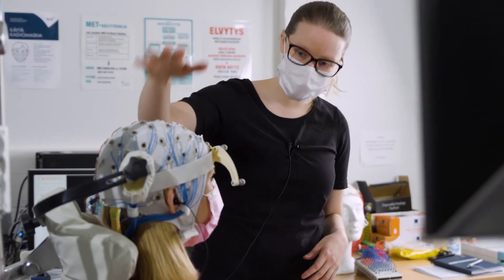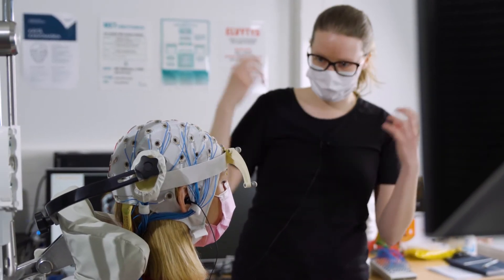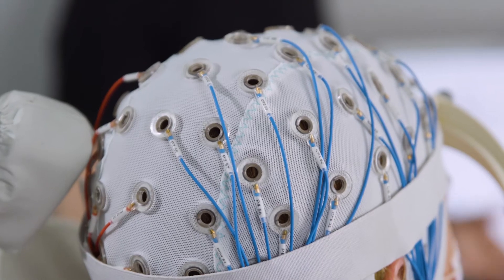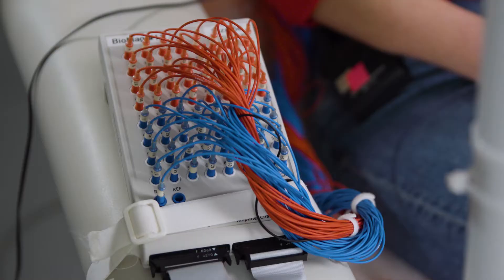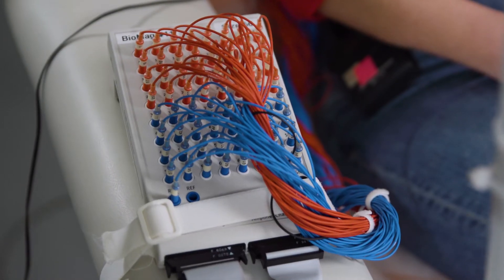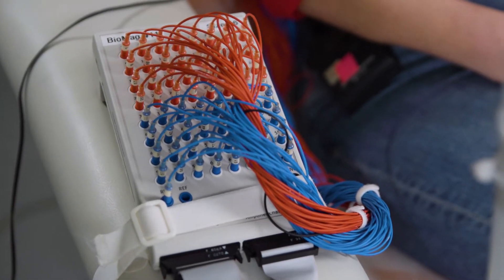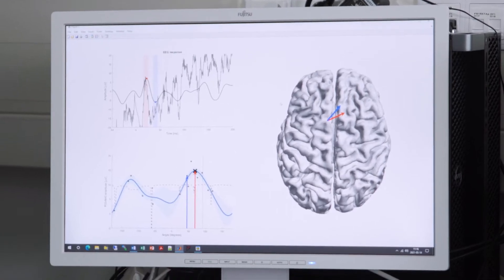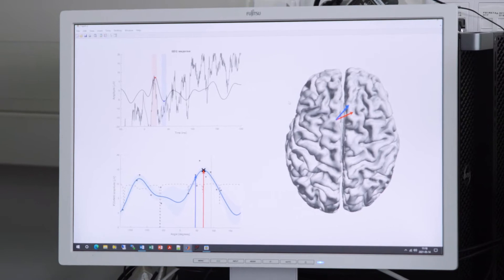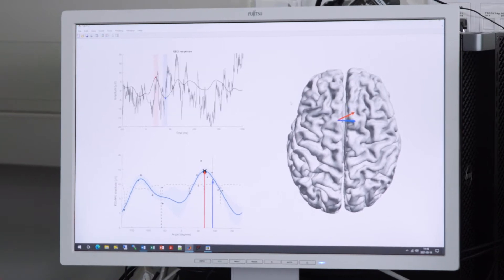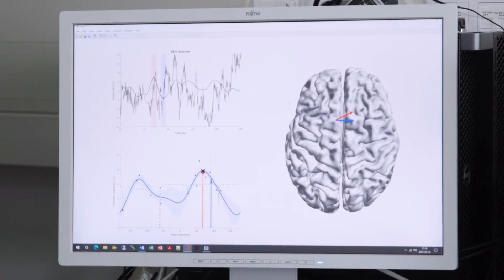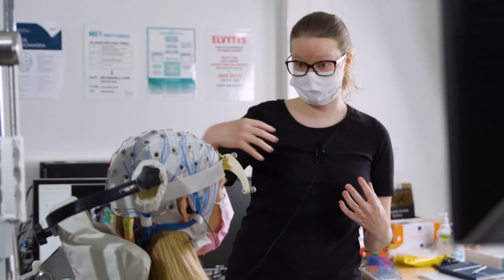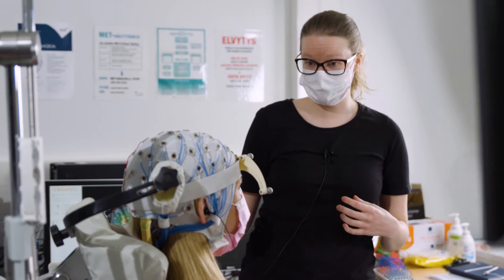We have placed the EEG cap on your head and attached it to the EEG — electroencephalographic — device that measures your brain activity. When we stimulate, it measures what happens right after the pulse.